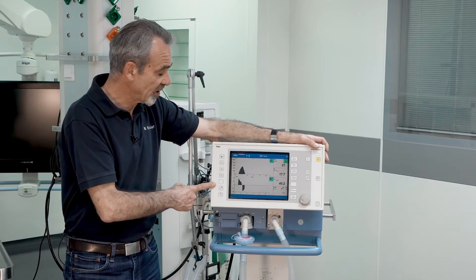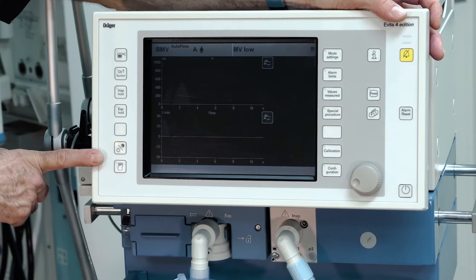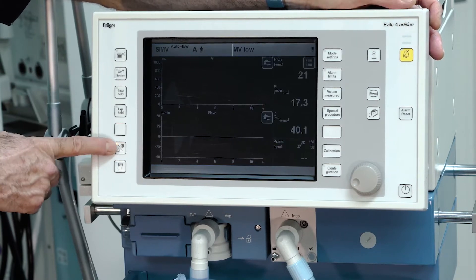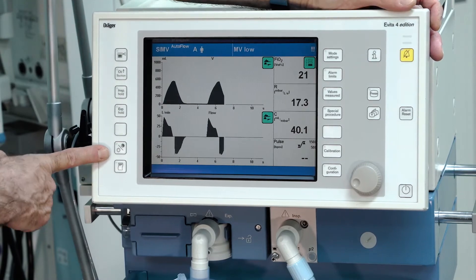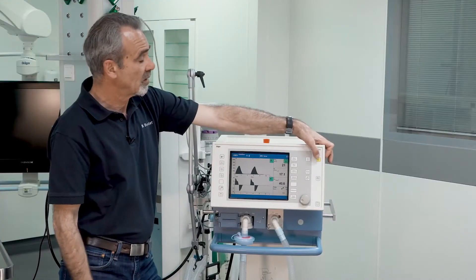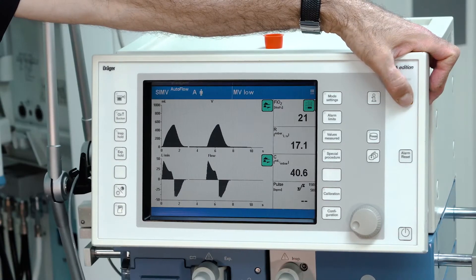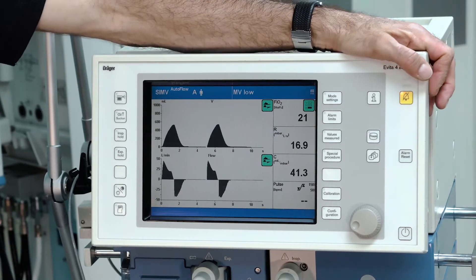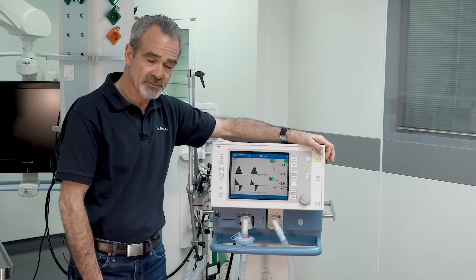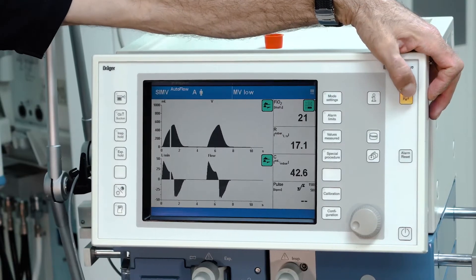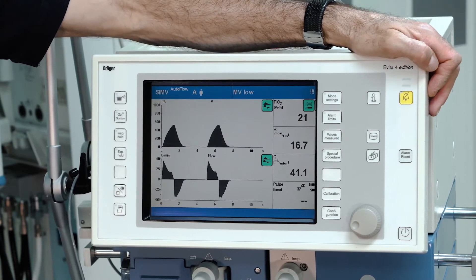To change the view between day and night, use the day-night button. With the button in the left upper corner, you can mute alarms for two minutes. If you want to stop the mute earlier, just push the button again.